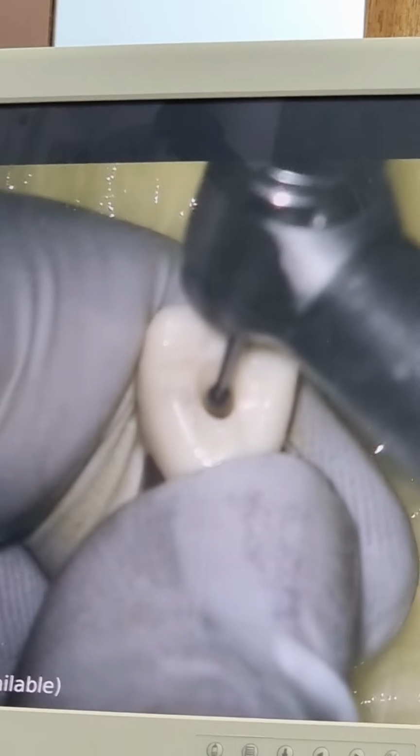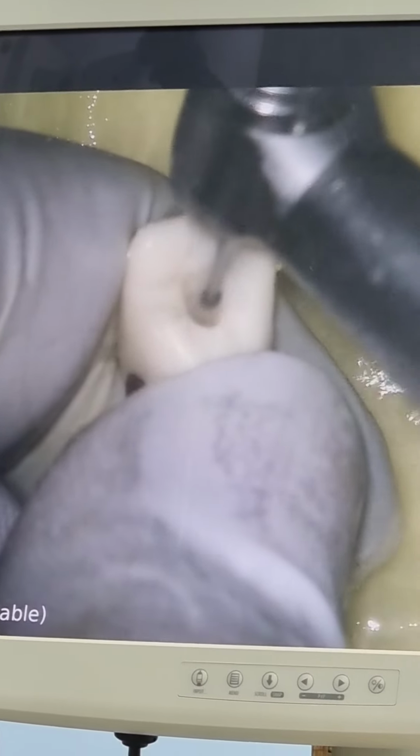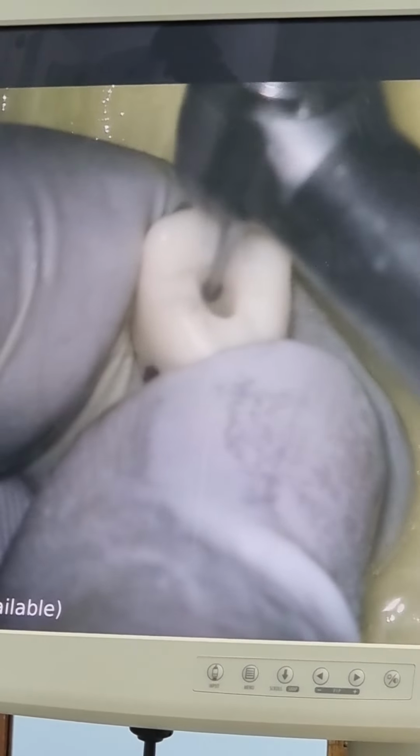So you keep on doing this de-roofing with the round burr, and once you have done the initial de-roofing, then for the final de-roofing or completion of the walls, you can change the burr from the round burr. You can take the other burr which I told you, Endo Z or safe-ended taper fissure burr, any one of these.